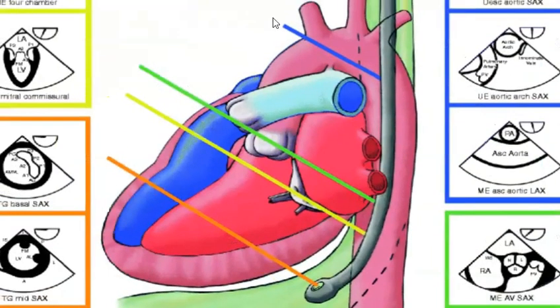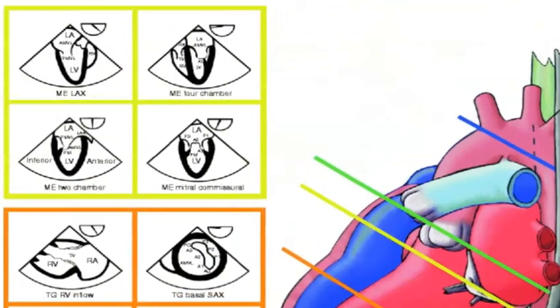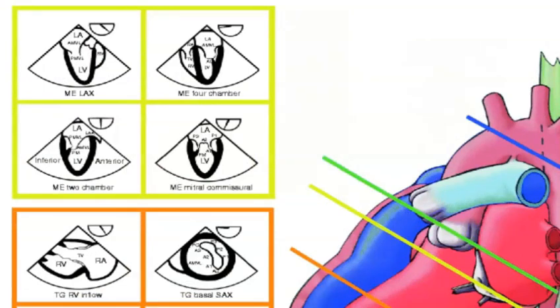I guess I can't, but if I move this over here, you can see this box here. This tells what angle we're at, and you can see this when you're doing a TEE with the physician, where this would be 0 degrees and this would be 180, and anything in between. For example, at 90 degrees, they're straight down through the heart, inferior, anterior. At 4-chamber, they are almost at 0 to 5 degrees, and so on and so forth.